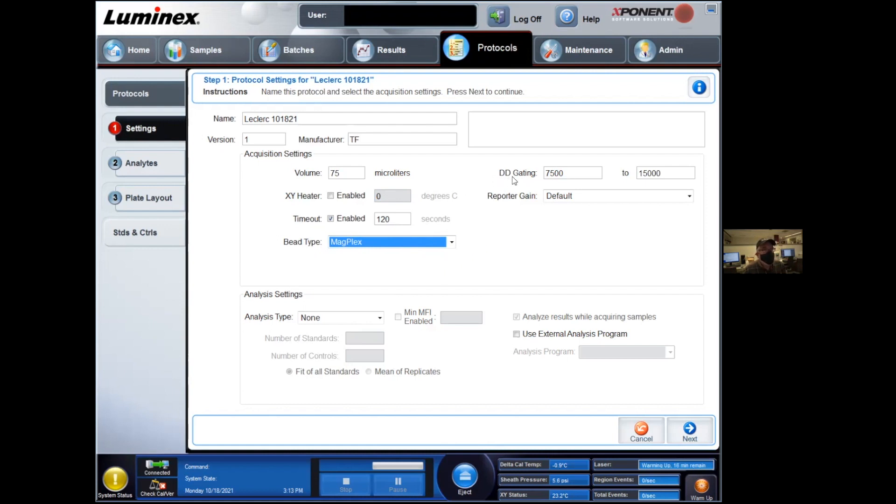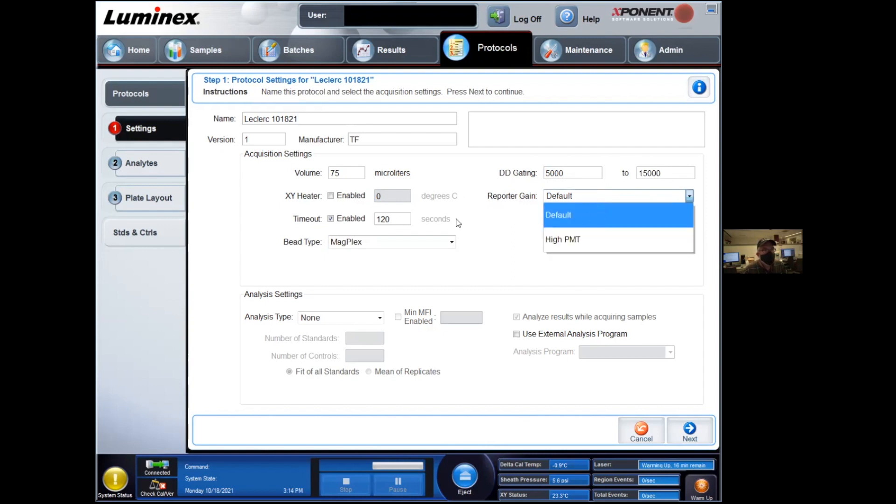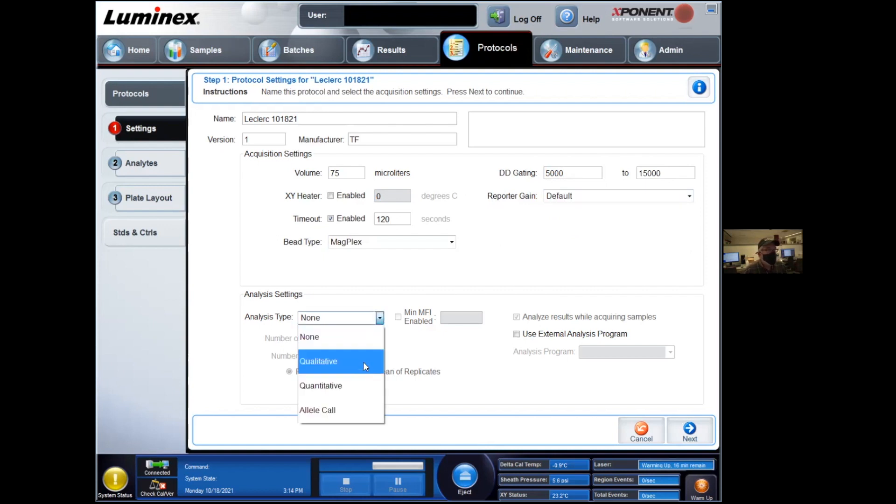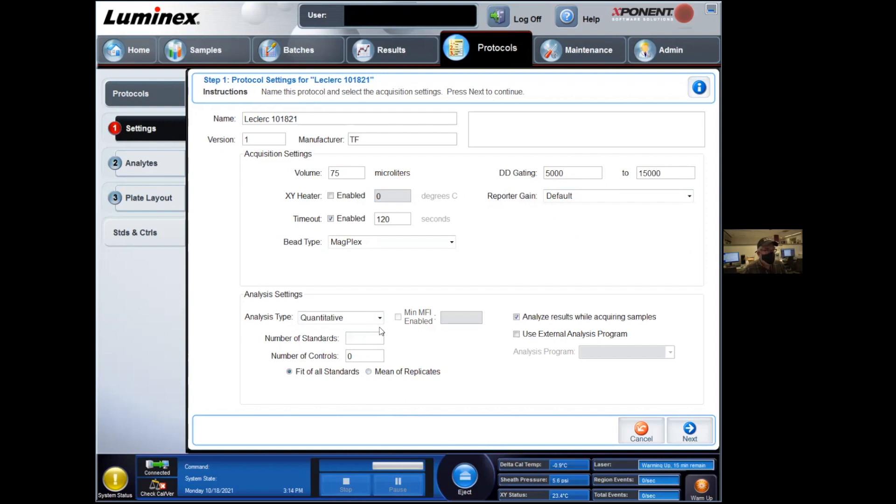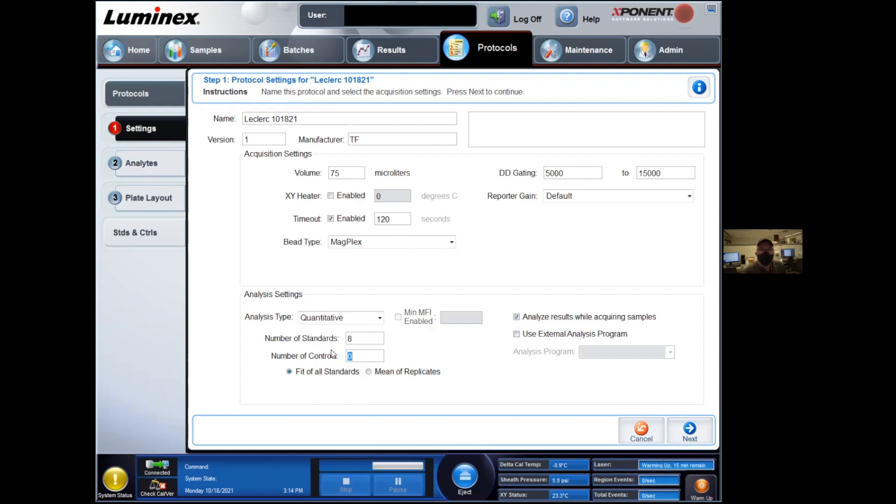Doublet discrimination gating. Again, the values are typically in your experimental booklet. It's going to be something around 5,000, 15,000 or whatever the manufacturer prefers. Reporter gain, you can use default or high PMT in some cases if you're looking at really dim expression of your analytes. Analysis type in general will be quantitative and then you're going to be asked how many standards and how many controls you want to enter. In general, I am going to enter the number of standards, but not the number of controls simply because I'm lazy.